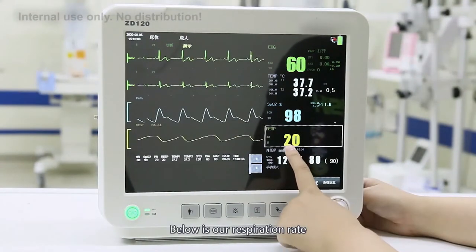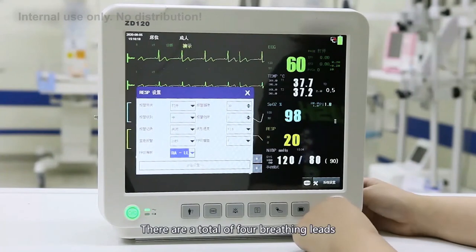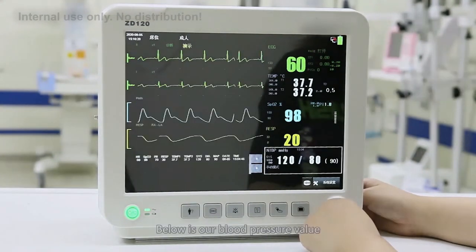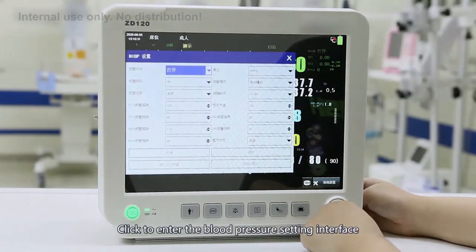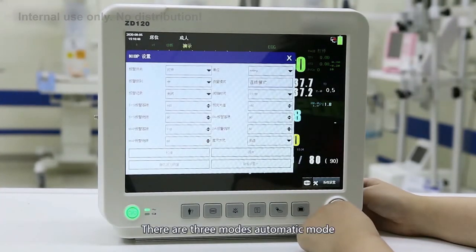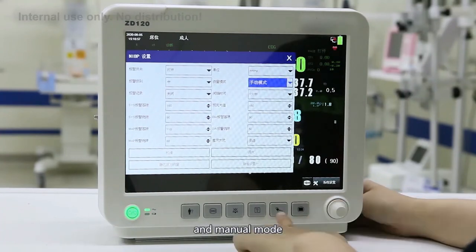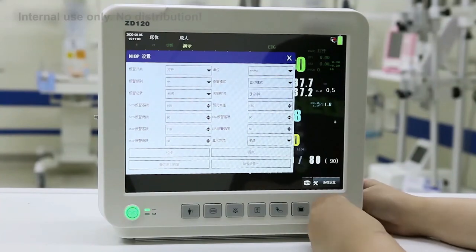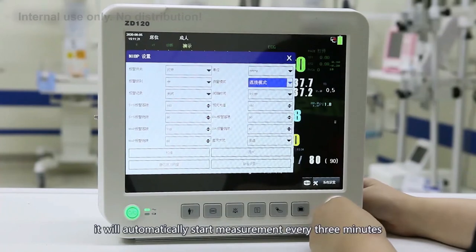Below is the respiration rate. The respiration rate setting is mainly to configure breathing needs. There are 4 breathing modes that can be selected to make breathing rate monitoring more accurate. Below that is the blood pressure value. Click to enter the blood pressure setting interface, where you can set the measurement mode. There are three modes: automatic mode, continuous measurement, and manual mode. In manual mode, press the measurement button to start. In automatic mode, you can select the interval time for automatic measurement. Continuous measurement will automatically start every 3 minutes.